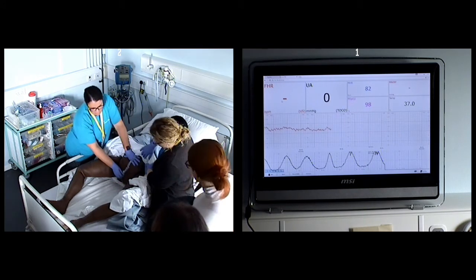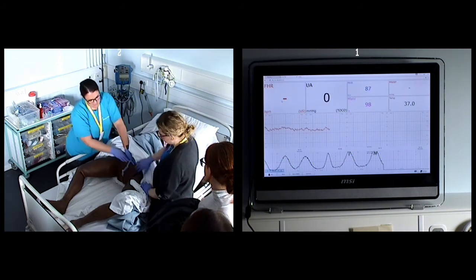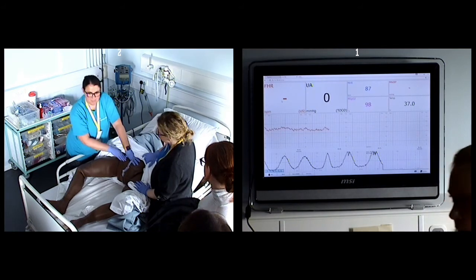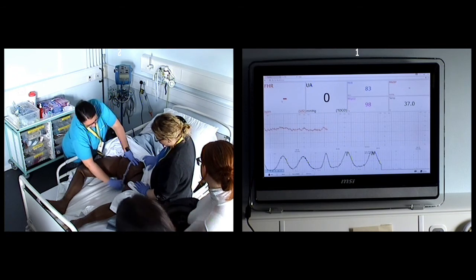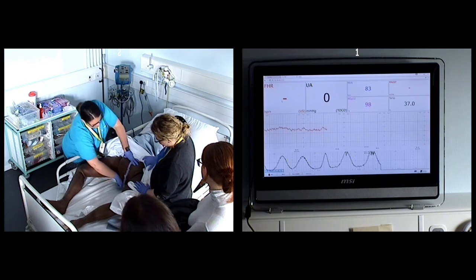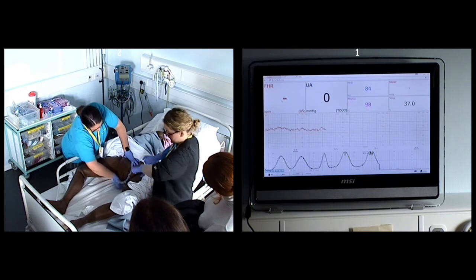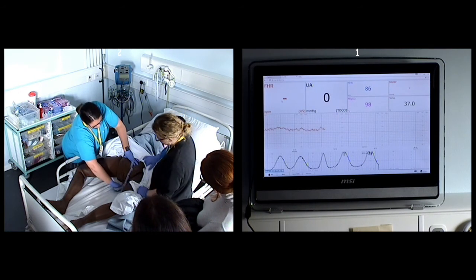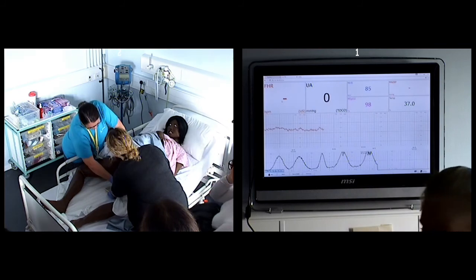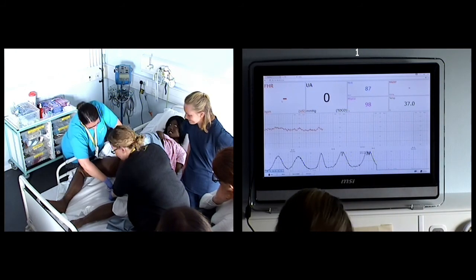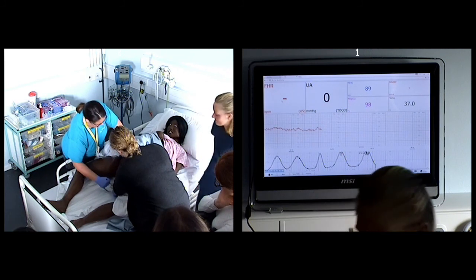If we were to pull the placenta without guarding the uterus, you could pull the whole thing out and invert it — actually turn it inside out. So we always put our hands over the top to guard it. There are clamp scissors on the cord to use as traction. She has a long cord in there — normally we put a clamp on so you have something to use. You'd have a kidney dish here usually. There it comes — well done!